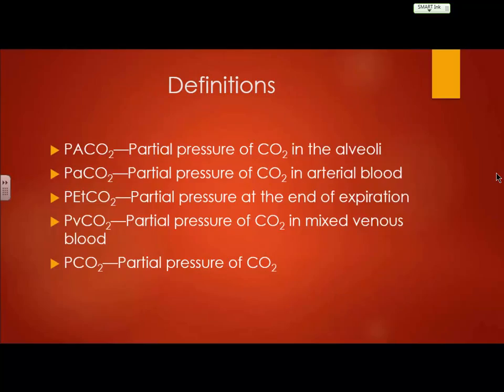All right, so I'm not going to spend a lot of time on these partial pressure definitions here, simply because we went over these before, and the main ones that I want you to know for this lecture are the PETCO2 and the PaCO2. Now, one of the things you will notice is that both of these are the same letters, but this is a capitalized A, so this is actually the partial pressure of CO2 in the alveoli. Alright?